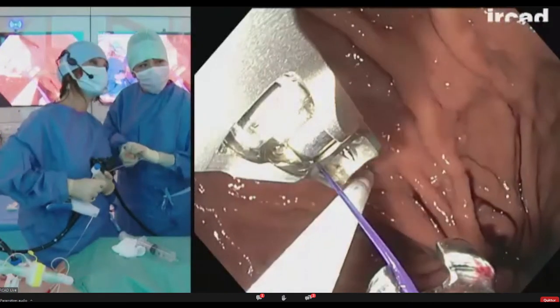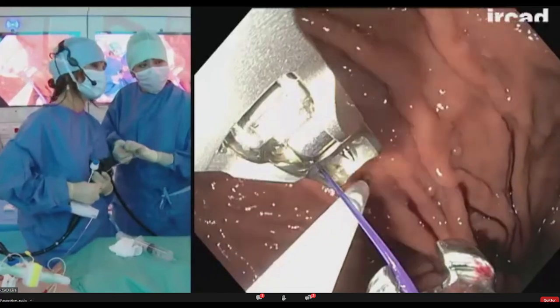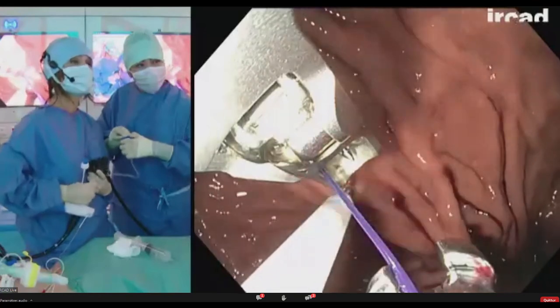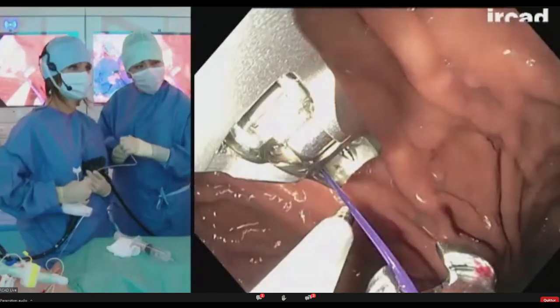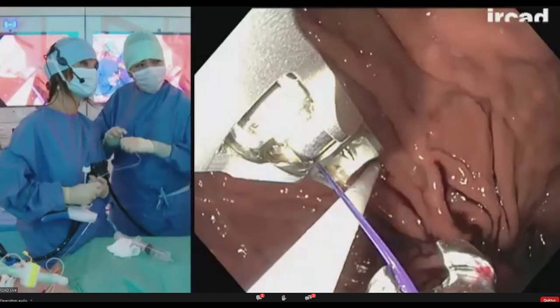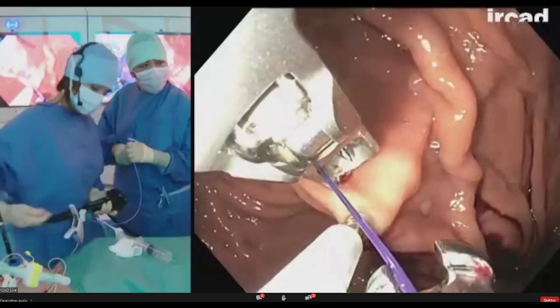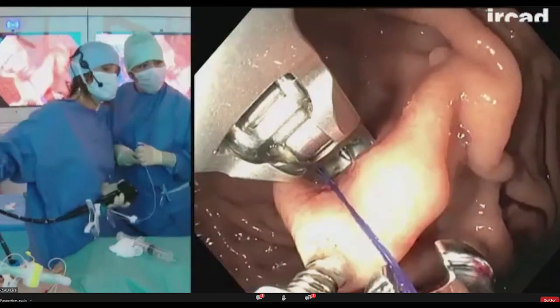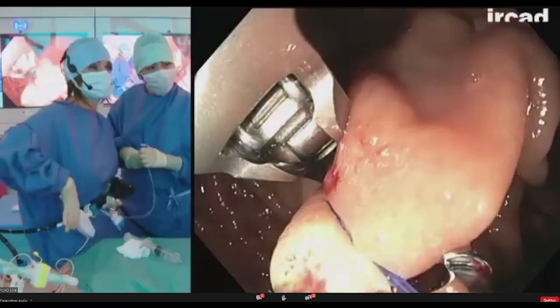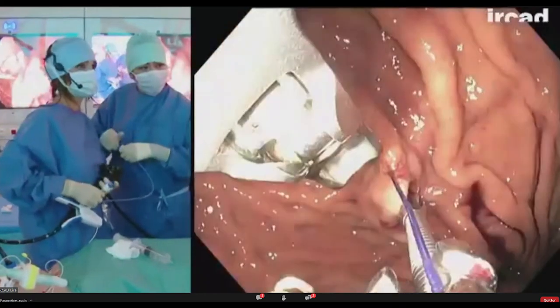So here, let me show you this. We grabbed a little bit too much, and you see that I have a resistance. So I'm going to ask Rita to undo one. And now it comes much better. We're going to do it again. When it doesn't want to come, do not insist. Change spot, and just be careful. Don't insist. Yeah, and we can see how beautiful.